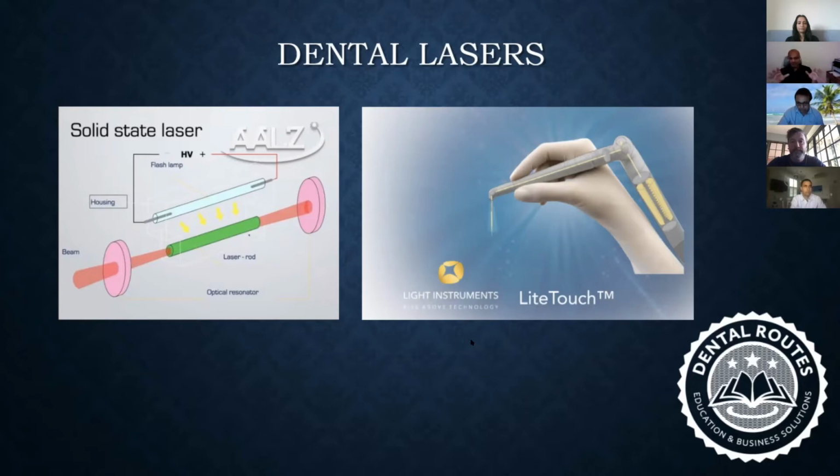There are three, four colors in it. The green rod that you can see is what stimulates a laser beam, or which is where the laser beam comes out of. The blue rod that you can see is called a flash lamp, and this one somehow either sends energy in the form of light or heat or some way to excite that green rod. And when the green rod gets excited, it is going to release photons or photon energy.